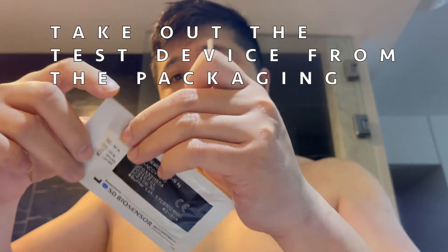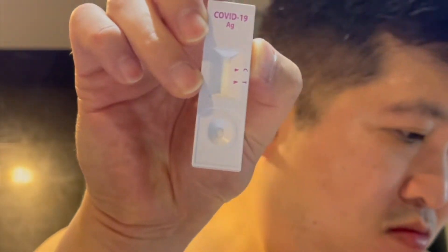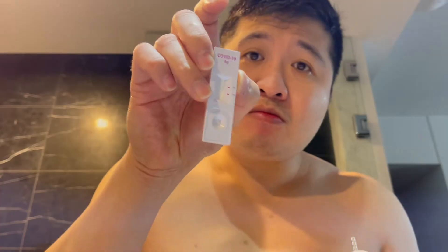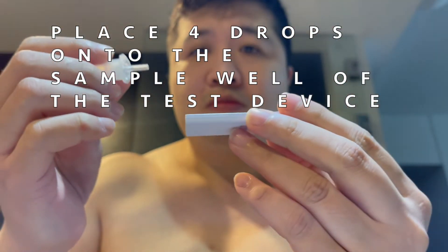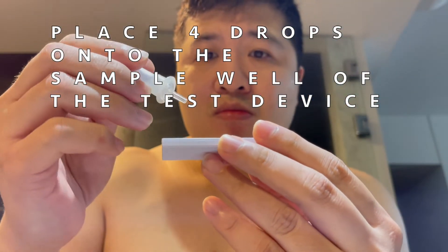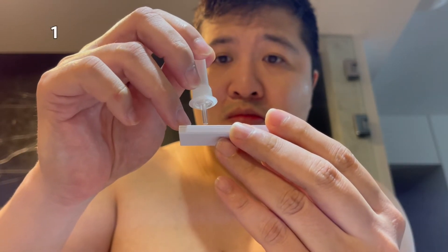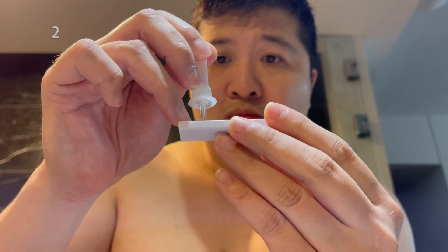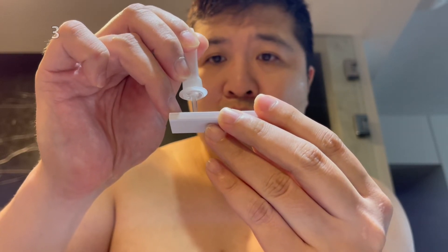Take out the test device from the packaging. Place 4 drops onto the sample well of the test device: 1, 2, 3, 4.